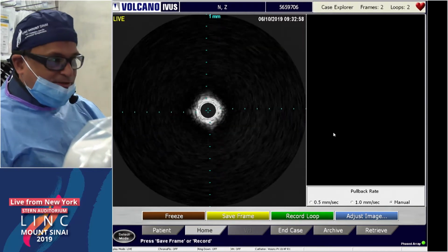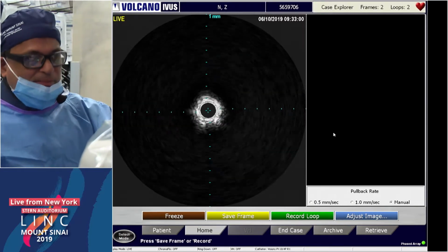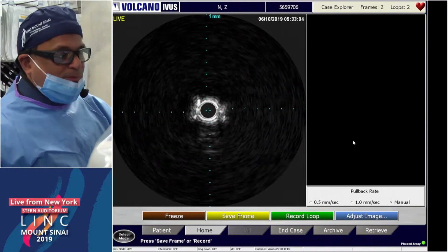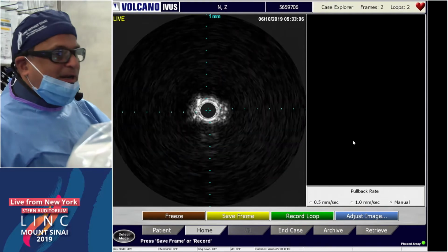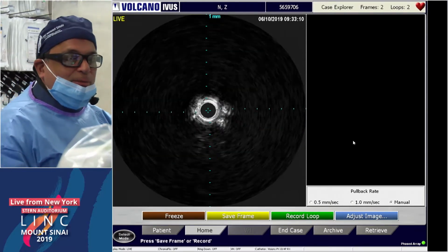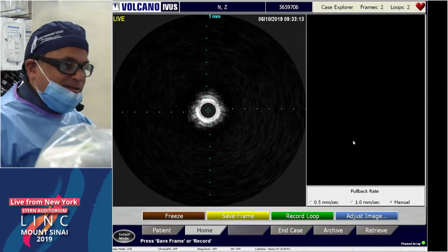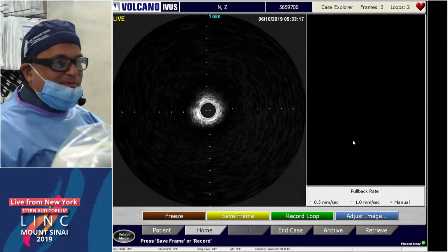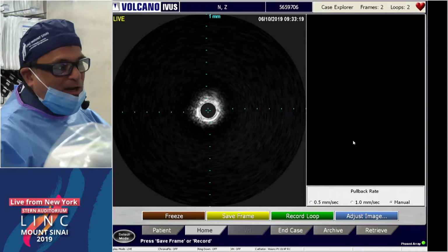You know, Dirk, that's a great point. I just want to tell you our algorithm. In common femoral in our hands, we feel the Jetstream is the most effective device. With directional atherectomy, because of the tortuosity of the iliacs, we have difficulty. We have to retract the sheath in order to actually get the toggle of the directional atherectomy device. So with the Jetstream and these types of eccentric calcified lesions, we like the Jetstream.